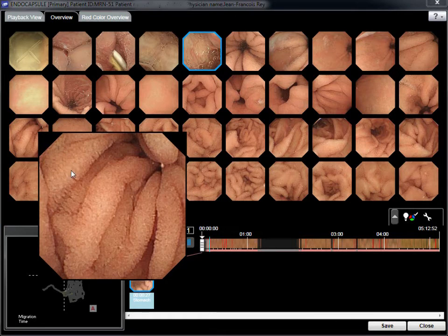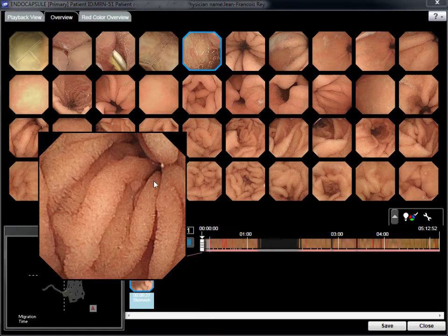Individual frames can be enhanced, or a sequence of still images can be analysed in playback view.